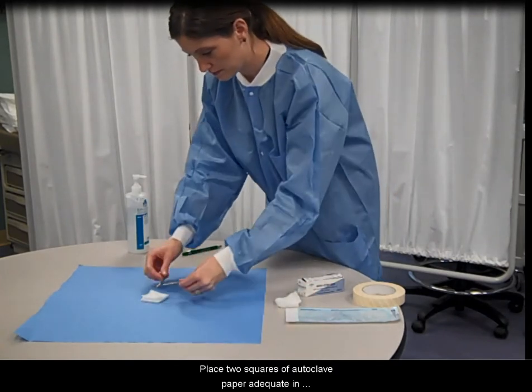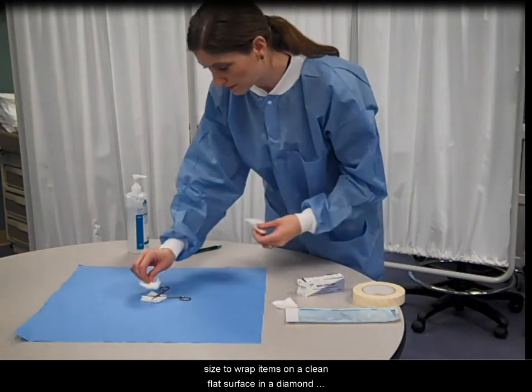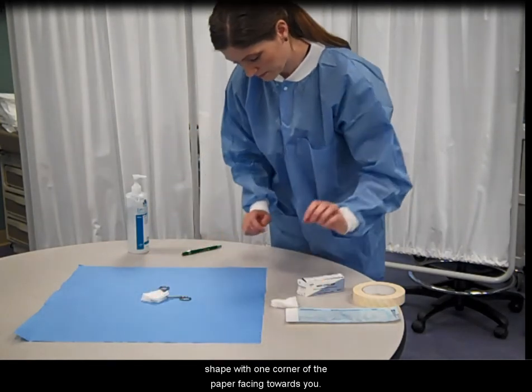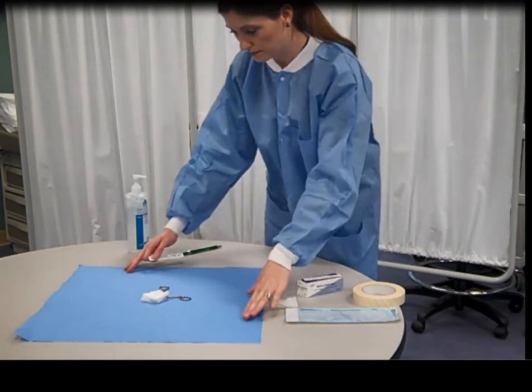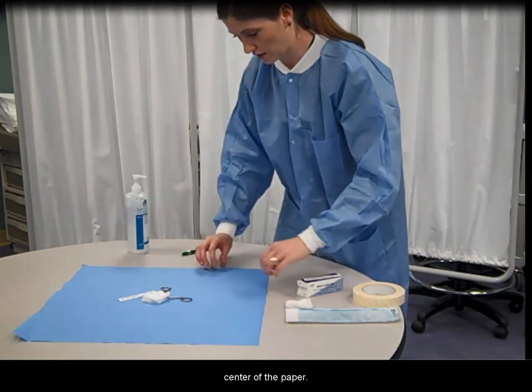Place two squares of autoclave paper adequate in size to wrap items on a clean flat surface in a diamond shape, with one corner of the paper facing toward you. Place items as well as a sterilization indicator in the center of the paper.